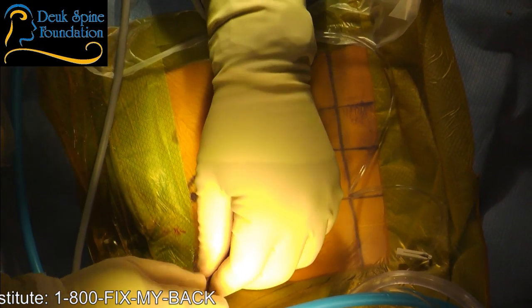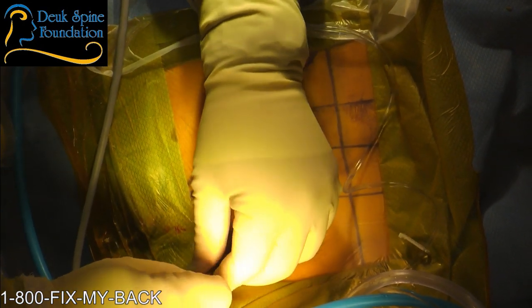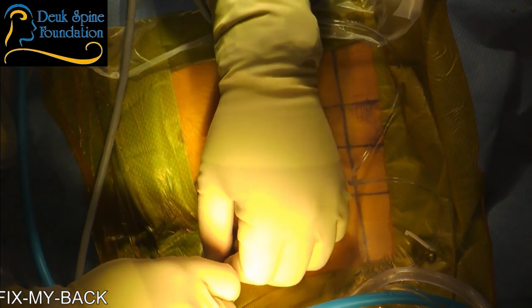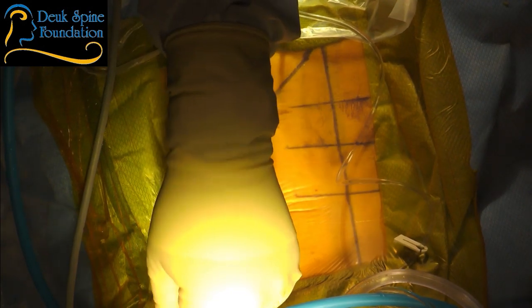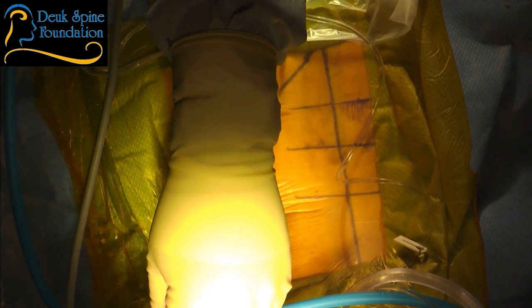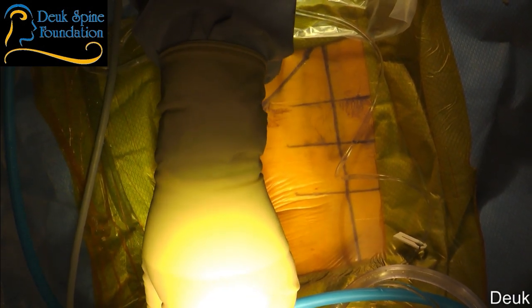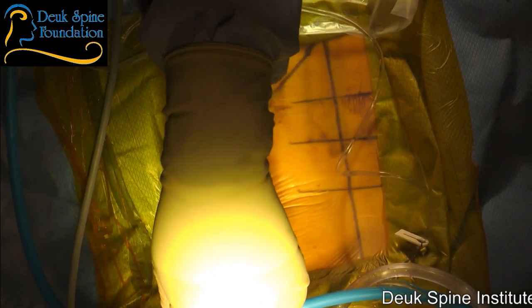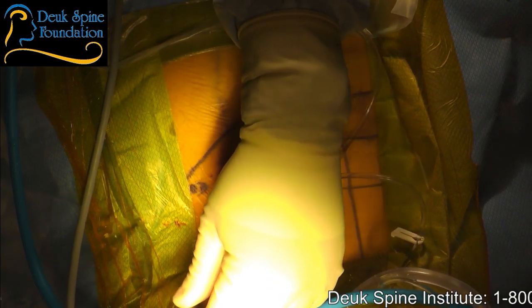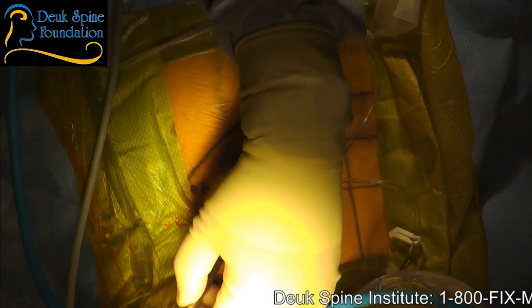So it's as minimally invasive spine surgery as it gets. There's nothing less invasive than this. This is the smallest incision and least invasive. Shot, and we're going to get all three discs done with one incision. So we didn't have to do a second incision.